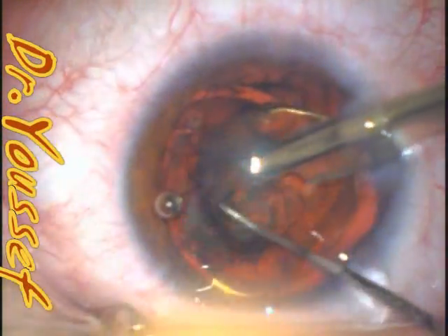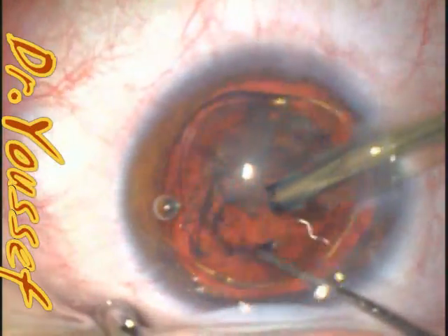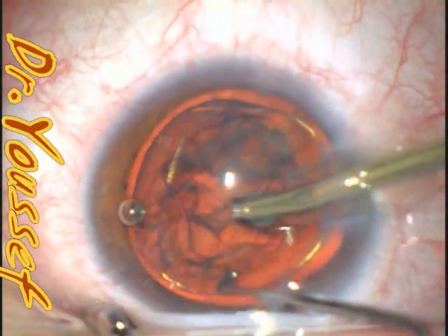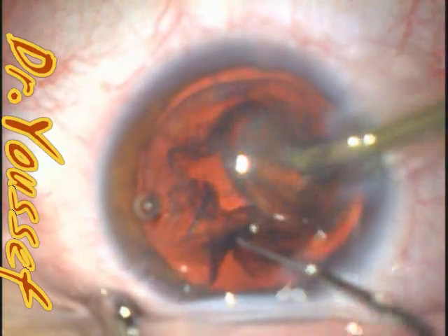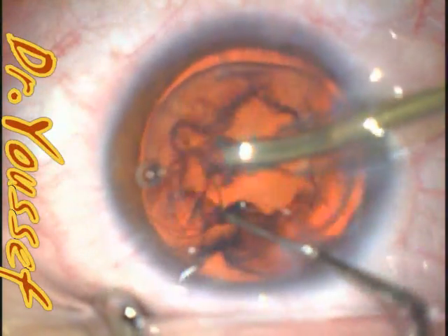So the case is going well — routine phaco — remove the nucleus, followed by the epinucleus. We can clean up using the j-cannula.